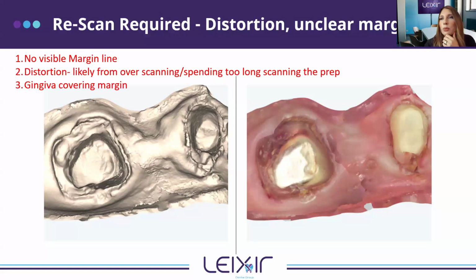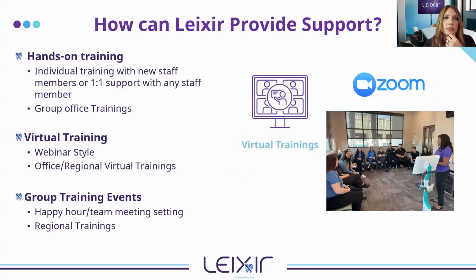I know we understand, obviously it can be challenging. Every patient presents differently. But even notating to us, if you know that there's something missing or it was a very subgingival prep, put it in the notes to the lab so that we know, okay, they did see this. We're going to do the best that we can for you for that restoration.